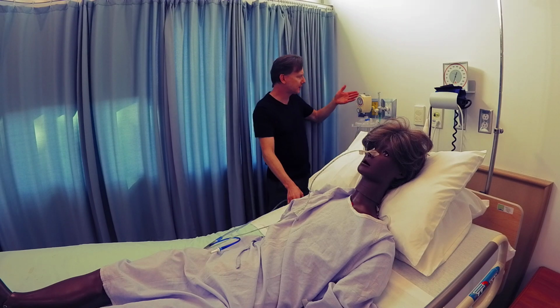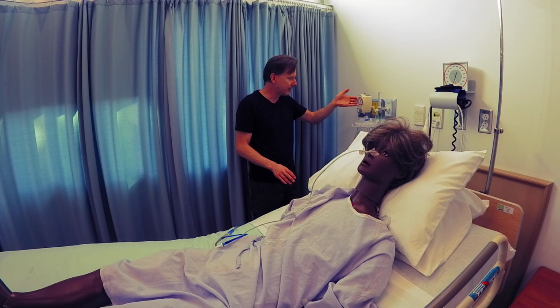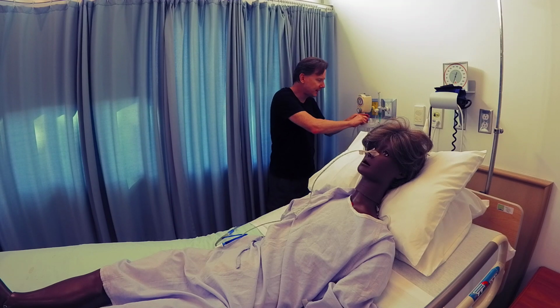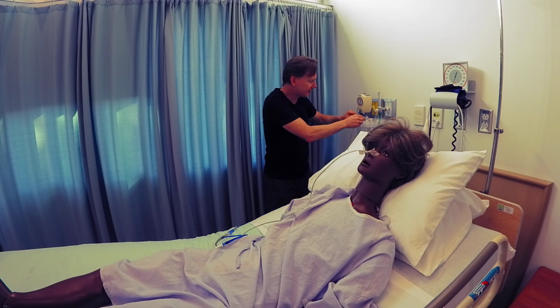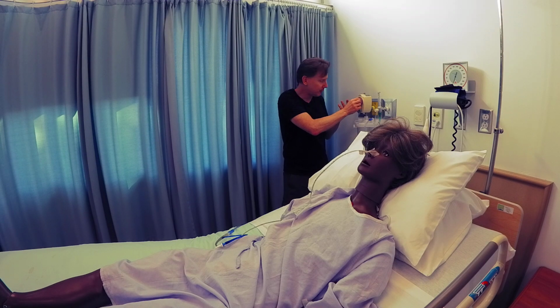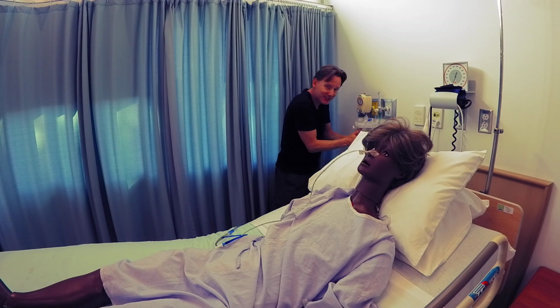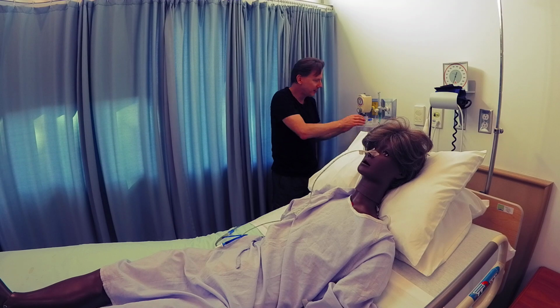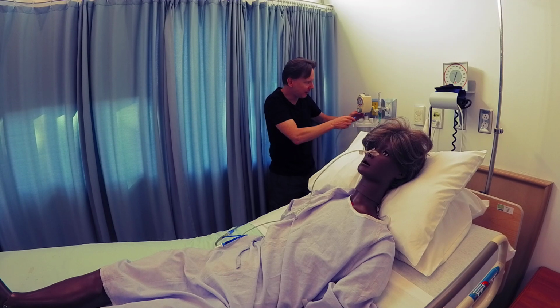Then you look at your actual suction system and you say, okay, is this working? Is the suction on the right rate? With gloves on, actually take this apart and check to see if the system is connected. I've had the situation sometimes where suction is showing at, say, 50 millimeters of mercury, but the actual suction tube from this device is not attached to this canister. So the whole system was never set up properly in the first place. You actually have to check to see if you've got suction working throughout the suction system itself.